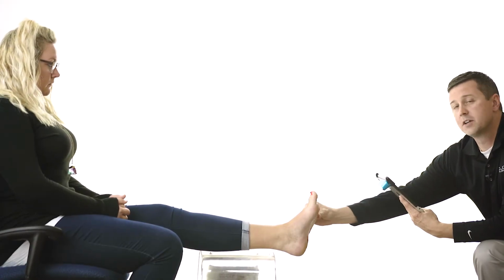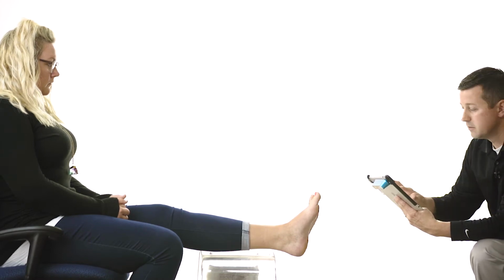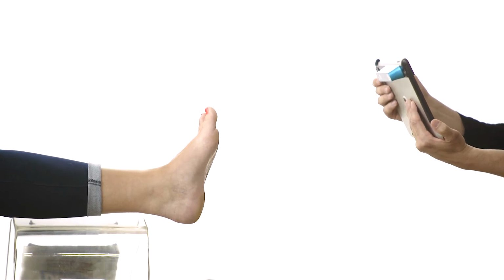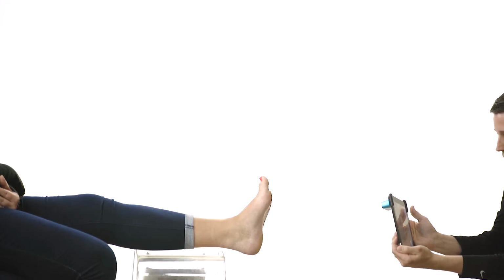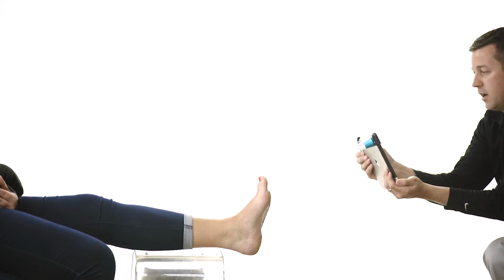Once we get the patient in the seated position, we'll have to keep her at a subtalar neutral position as much as possible before we start the scan. We'll have the patient hold their foot, and then we select scan. As we scan the patient's foot, we keep it in a 3-dimensional box, as we always do. As we rotate all around, it will capture the image of her foot, and then we click stop.